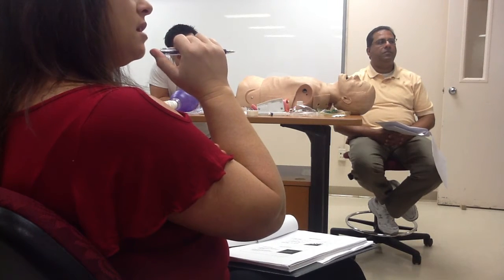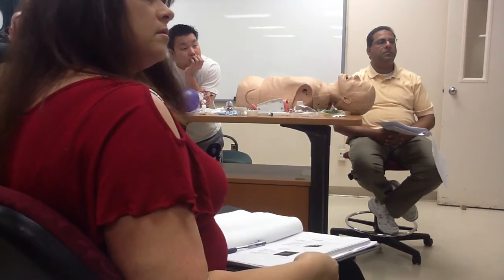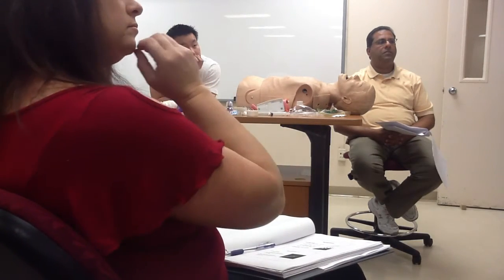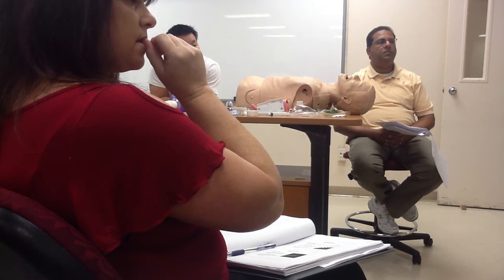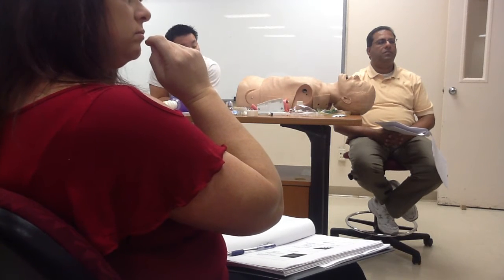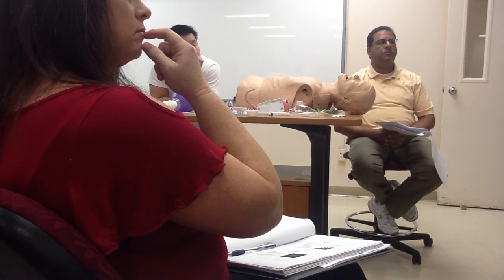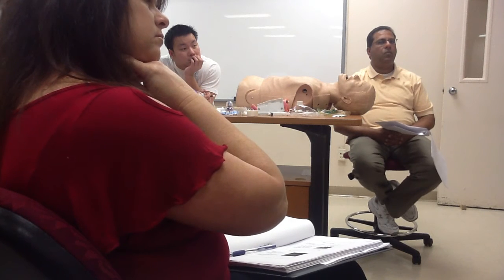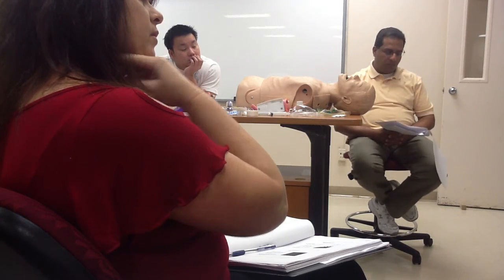That's the suction. So this little port will hang out of the mouth as well. And you hook a separate suction up to this one, and it slowly suctions out the saliva that falls behind your tongue. Now, when you set this, it's only set at 20. So it's hardly anything, because what if this is stuck up against your trachea? They don't want it suctioning the tissue from your trachea, so they keep it really low.